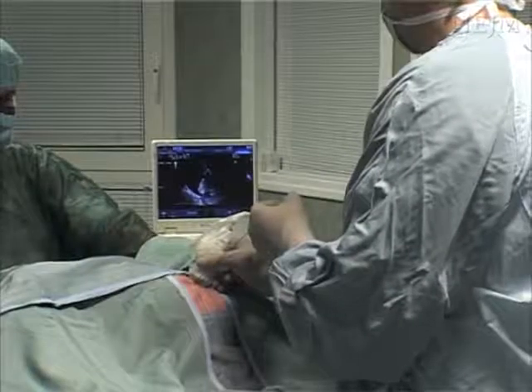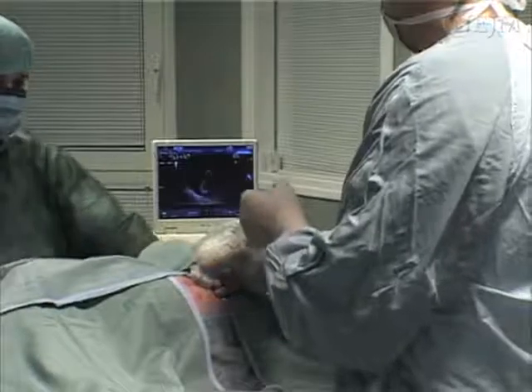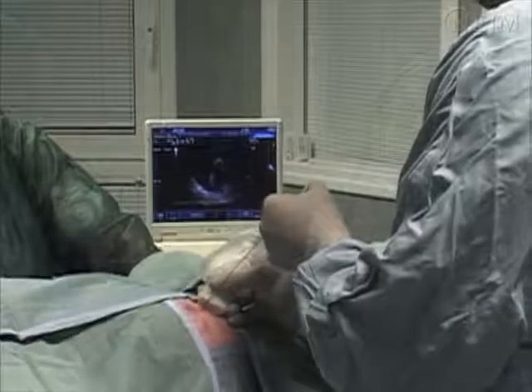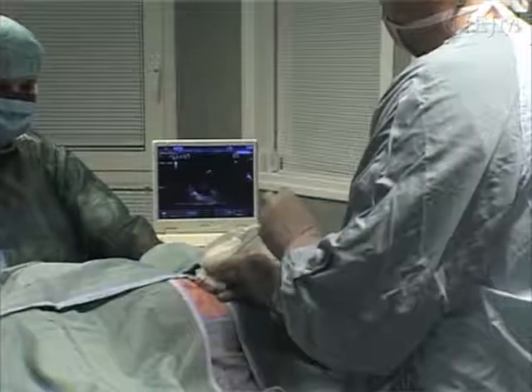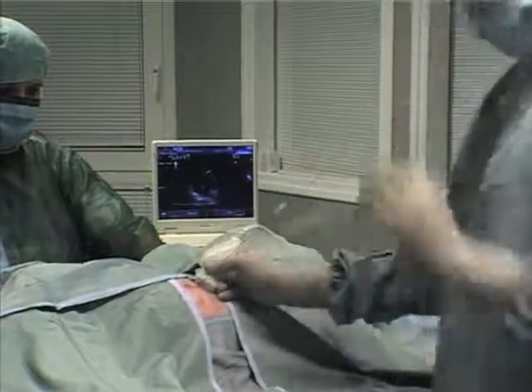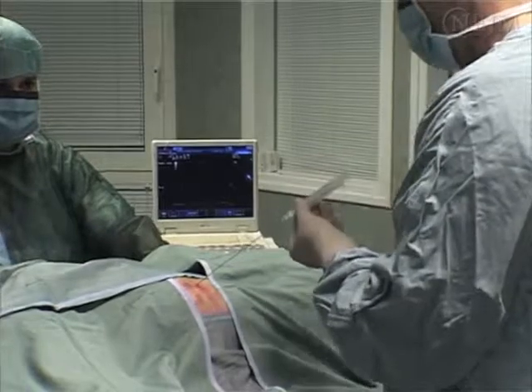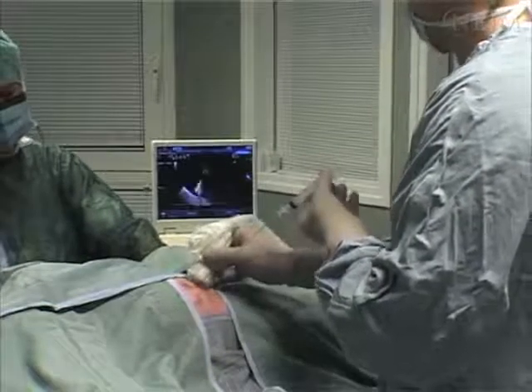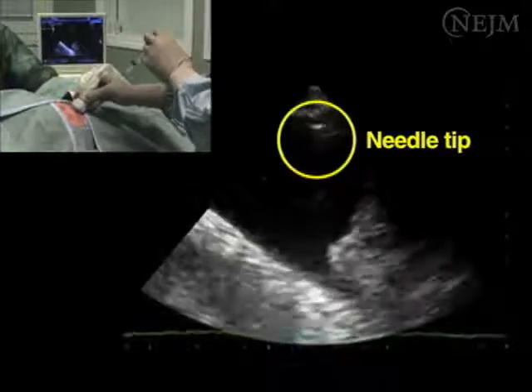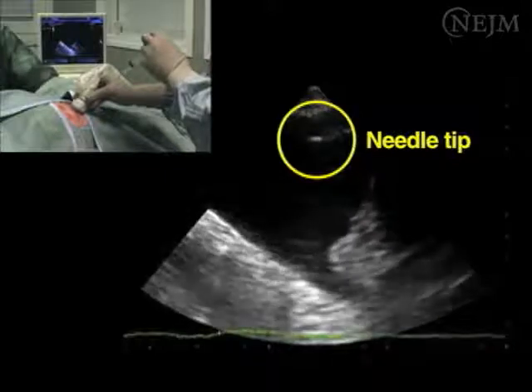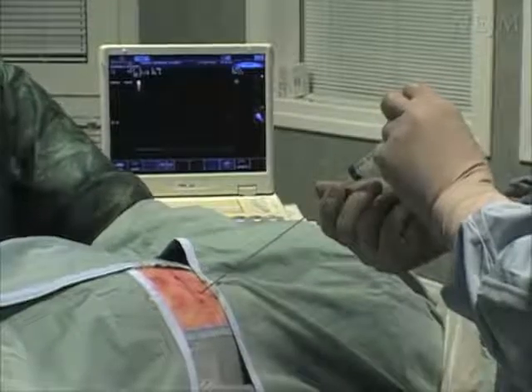Maintain the position of the probe on the chest wall and introduce the needle, with its stylet, to a length of about 1.5 to 2 cm through the skin, fascia, and intercostal muscle. Once the needle tip is close to the parietal pleura, remove the stylet and connect a 10 milliliter syringe to the distal part of the needle. Continue introducing the needle while gently aspirating, and identify the distal tip of the needle as it enters the interpleural space, keeping the structures below in view.